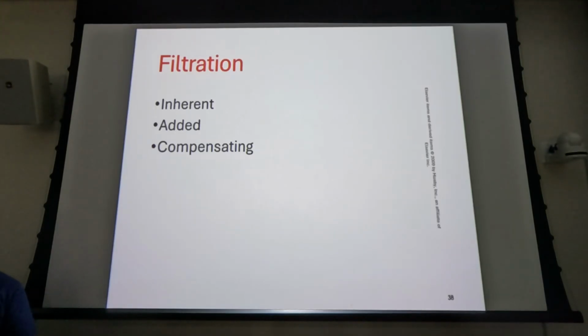So again, your engineer, your physicist is going to come in, and let's say an exposure that you made a year before at 10 mAs gave you, just to keep it simple, 10 mR of exposure. It'd be more like about 50, but 10 mR of exposure, we'll say. And this year, it's only giving you 9.